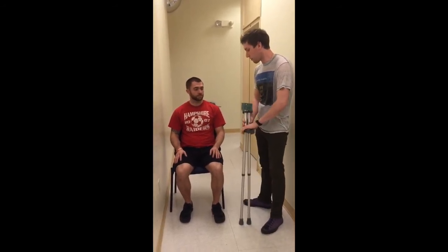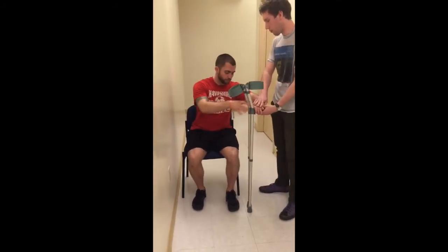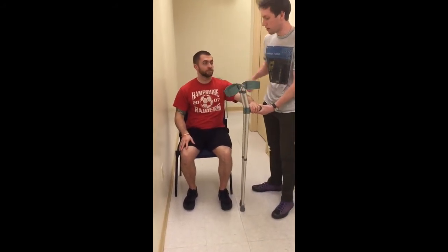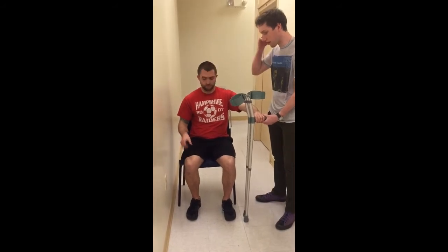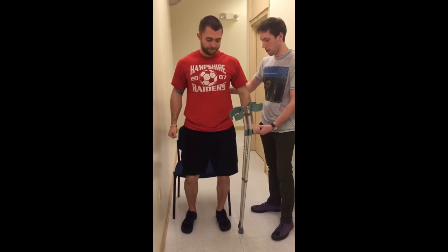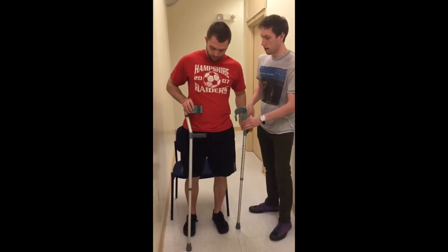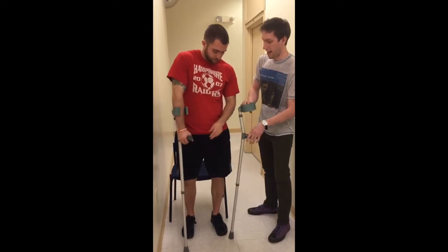So we're going to get you standing first, okay, Tim? I want you to grab onto these with one hand there. You can push off with the other arm on the chair if you feel like it. And we're just going to come into standing, okay? All right. So we're in standing. You can pass one off to your other hand. All right. And that's exactly how it goes.